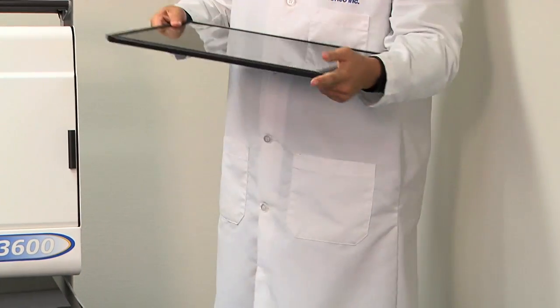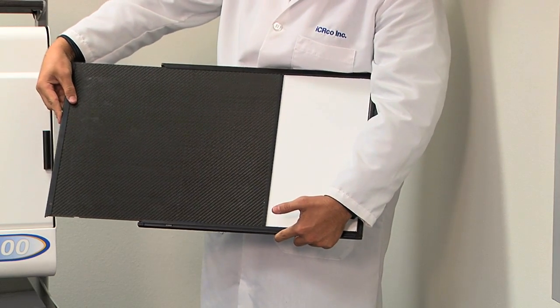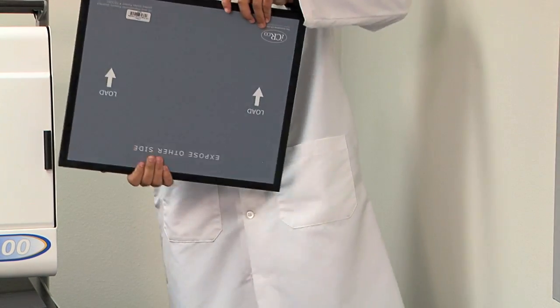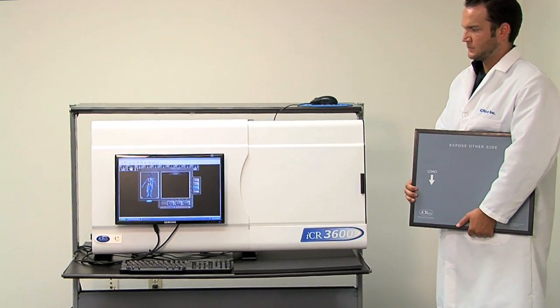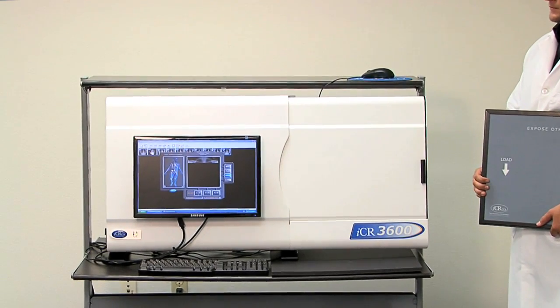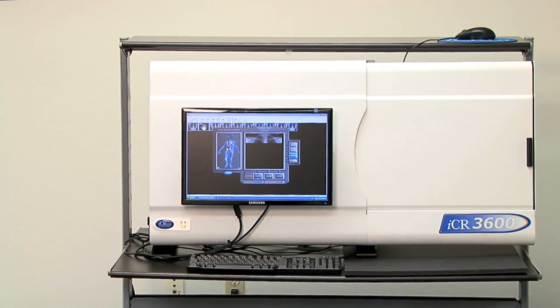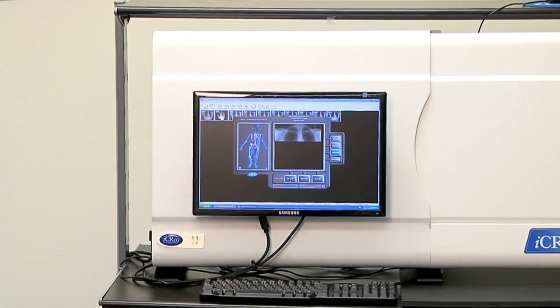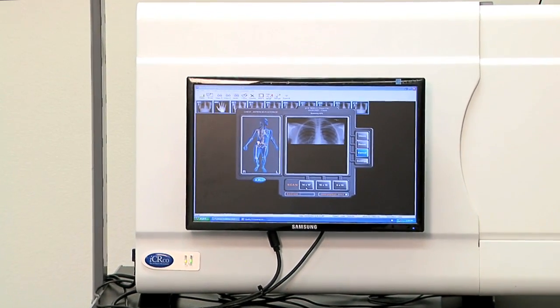What's happening right now is the cassette is being scanned without extracting the cassette. What makes ICR 3600 so powerful is its patented True Flat Scan Path technology. With this technology, the costly phosphorous plates are never exposed and they're not put through rollers like other systems in the market. This technology ensures you can acquire 300,000-plus artifact-free images per plate, making this CR second to none in affordability and reliability.